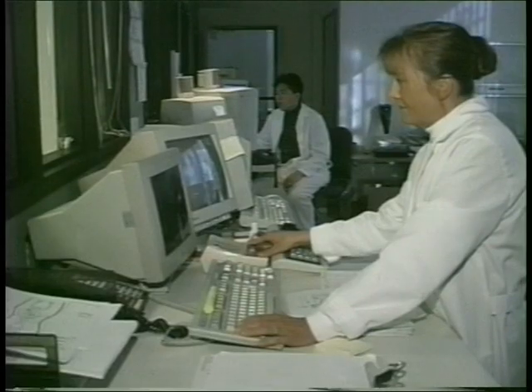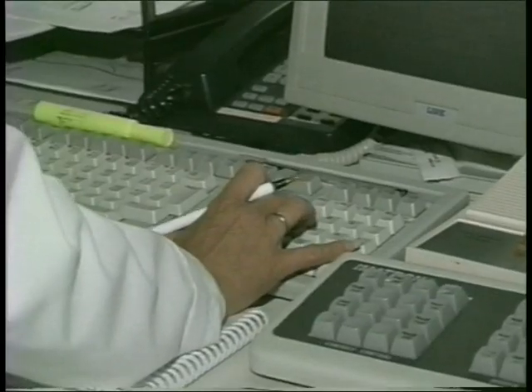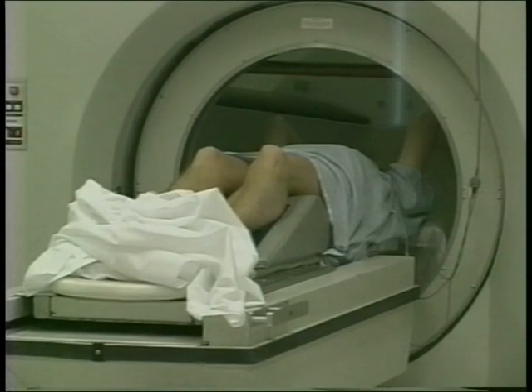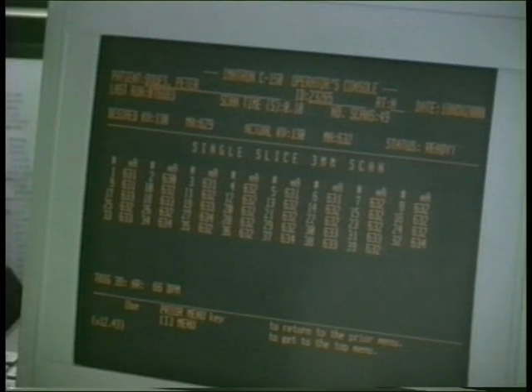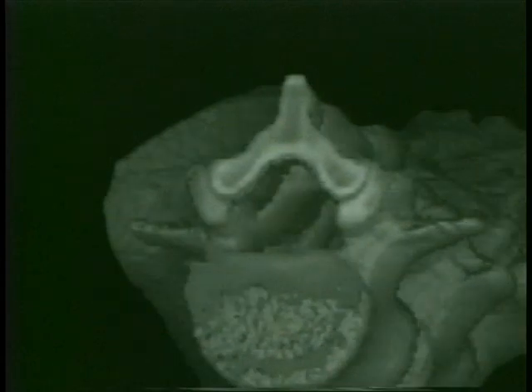Doctors at this private clinic say they discover something, a potential health problem, in everyone. They scan 30 to 40 people every day. As I found out, it's a daunting prospect. People regularly walk in here on a daily basis who are physically fit, eat a reasonable diet, have just had a recent stress test, and are at the stage of advanced cardiovascular disease, at high risk for sudden death from heart attacks. Hundreds of snapshot images are taken of the body, from the neck to the waist.